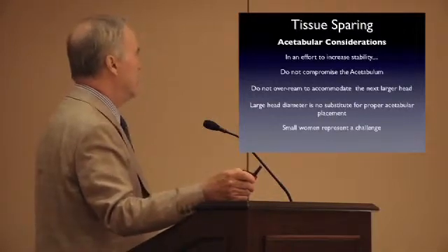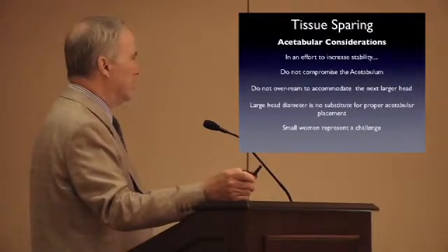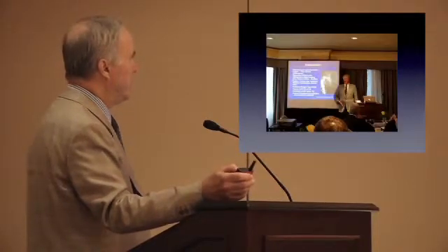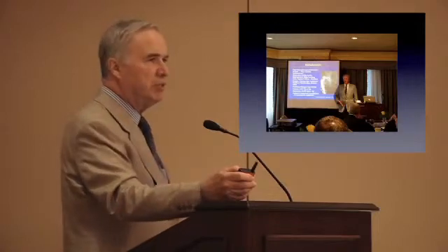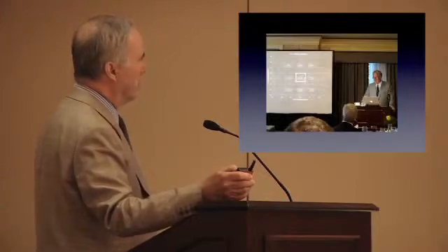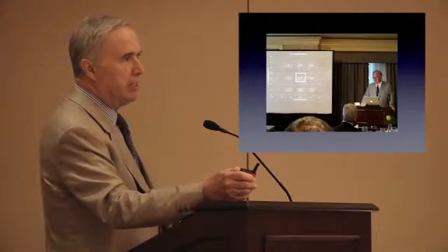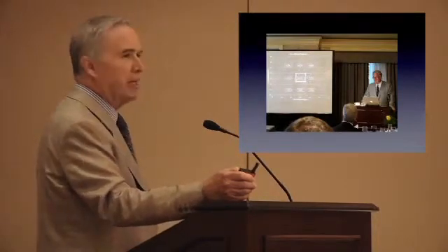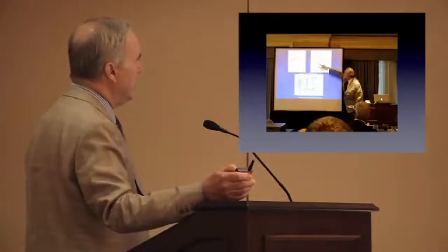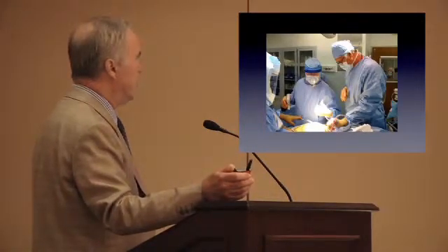So don't overream. Large head diameters are not a substitute for proper acetabular placement, and this is a typical problem with some small women. Dr. Rubash came and visited us, and he talked about the issues with respect to acetabular placement at Harvard. Look at all the hip surgeons at Harvard: as far as a sweet spot relative to abduction and anteversion, they were only in the sweet spot about 35% of the time. We were lucky enough to have him visit us to see the ARC stem in the operating room after his lecture.